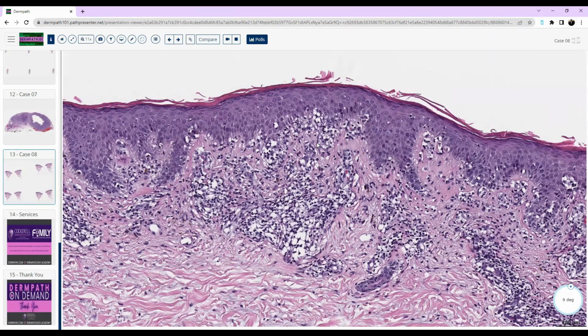I think it might be the B subtype or whatever, but it can look very, very much like MF histologically. It looks just like this, but it's got CD30 positivity. Of course, you get CD30 positive transformation in MF too, so you have to differentiate those clinically, papules versus plaques and patches. So that's one.